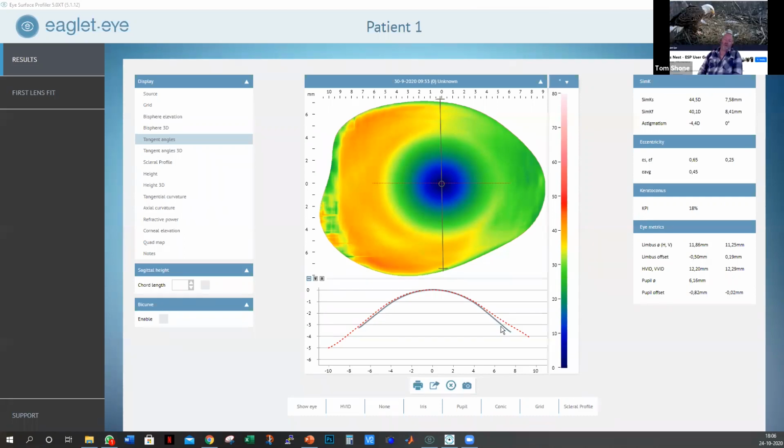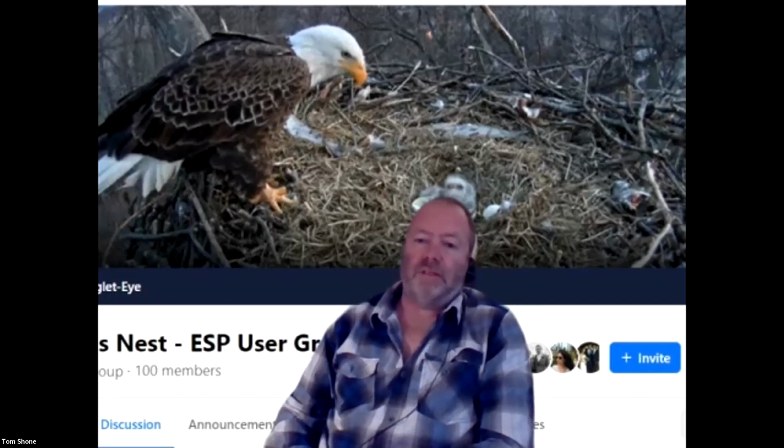So Gloria has another question, and that is, can this help with the centered optics, like on the Maxim? I added the like, Gloria. Sorry. Absolutely.